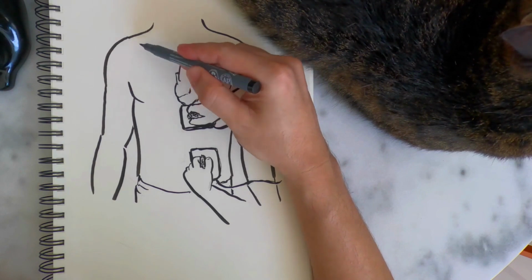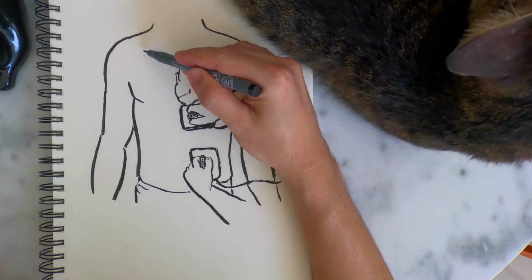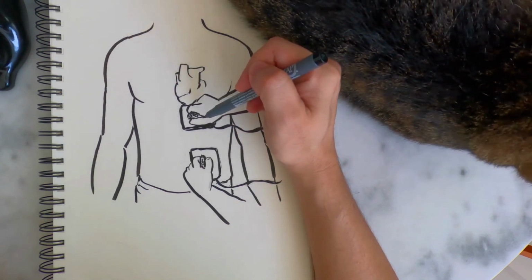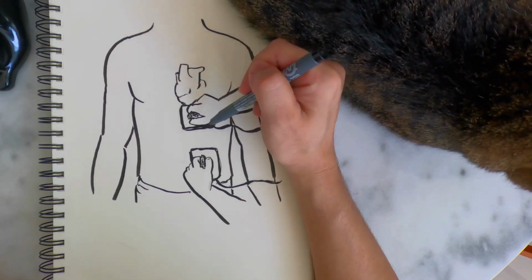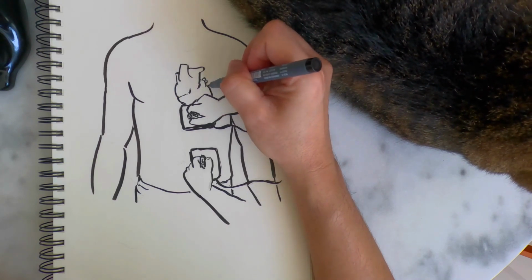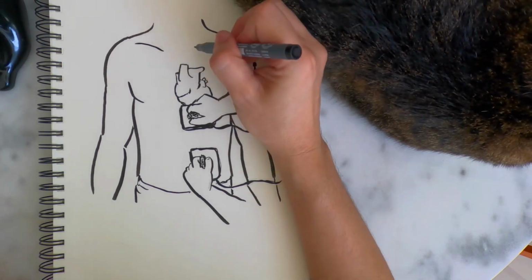If you get jolted on a power pole, it affects your entire body, and you might think you can place the pads anywhere on the left, right, or abdomen, but that's not true. The device is designed to limit the electrical current because if we were to shock the whole body to reach the heart, the electrical energy would be very high, which we need to limit. Therefore, the pads must be placed correctly. In this image, I'm pointing out that the pad should be placed on the right side of the chest, right below the collarbone.